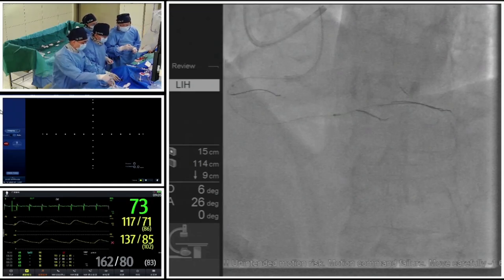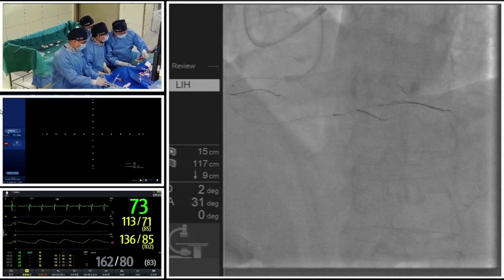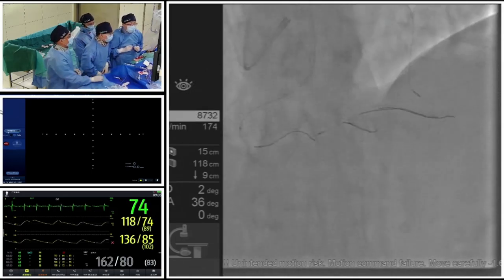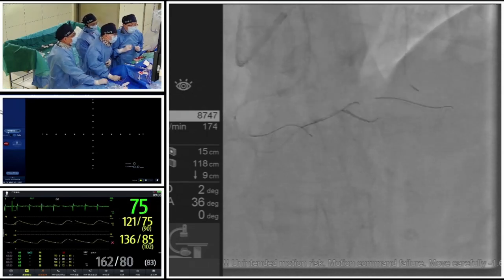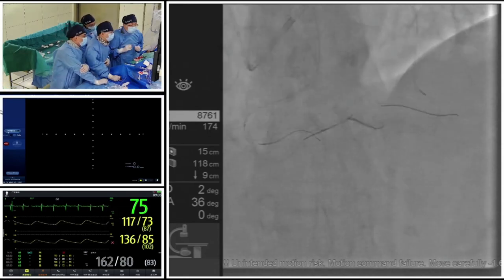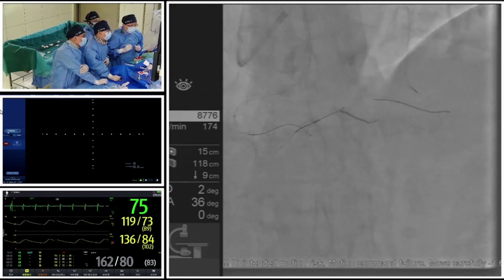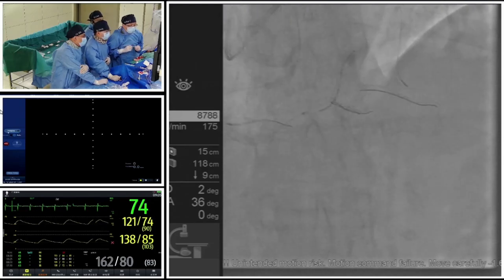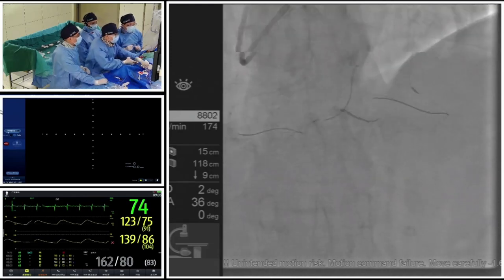Okay, so actually this is a great technique. We do not want to demonstrate this one live, but I think this is great information to teach, because collateral-related perforation is higher in patients with epicardial collateral than with septal collateral. Several techniques have been developed to deal with collateral branch perforation. However, our technique uses absorbable sutures to seal the septal or other small side branch perforation.